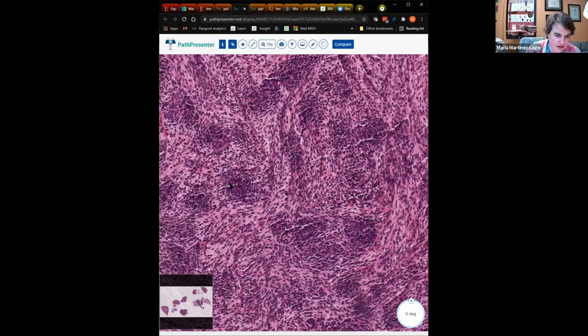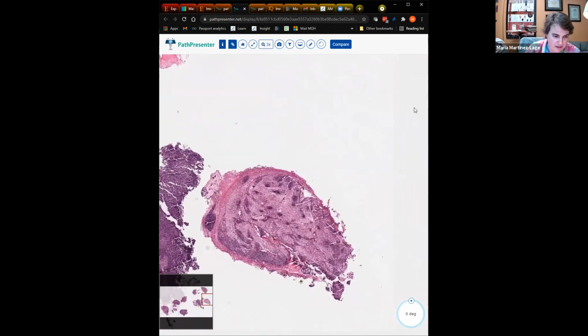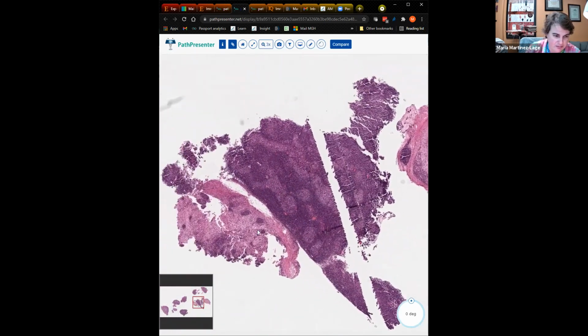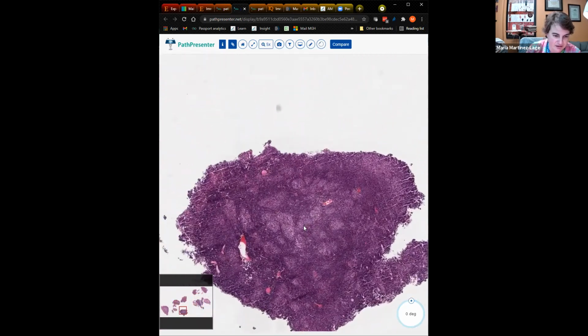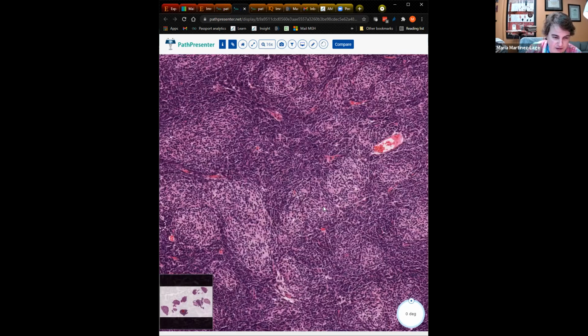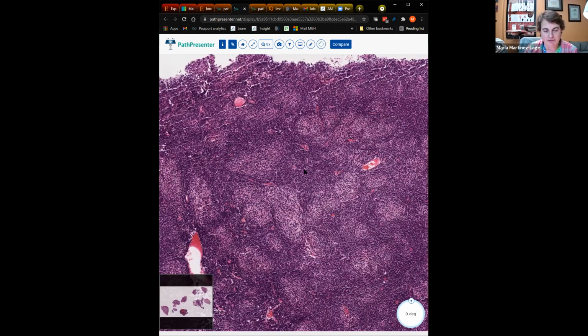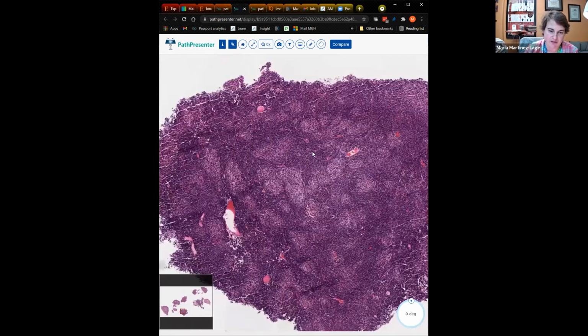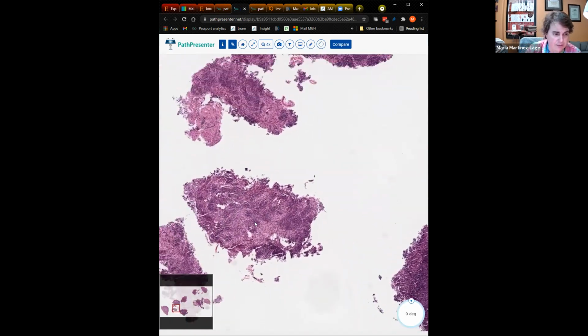This is a little bit unusual in that the nodules are more cellular than not. That would not be your typical desmoplastic nodular medulloblastoma, in which the nodules usually, again, are pale, like here, for example. If you were to do, for example, Ki-67, the background will be very high, whereas the nodules are usually a little bit lower because, again, they are quote unquote better differentiated.